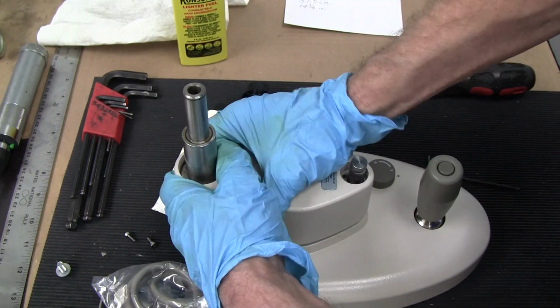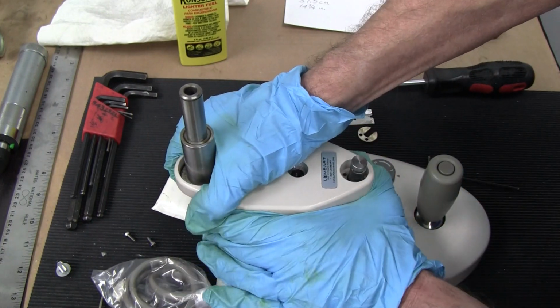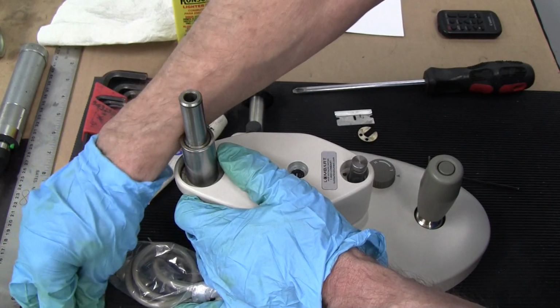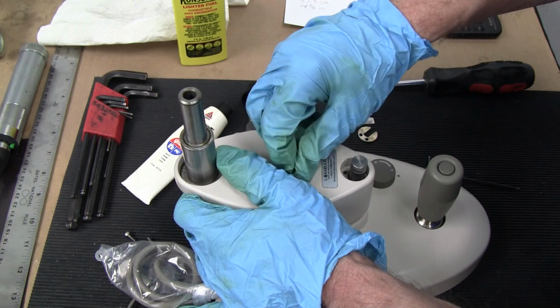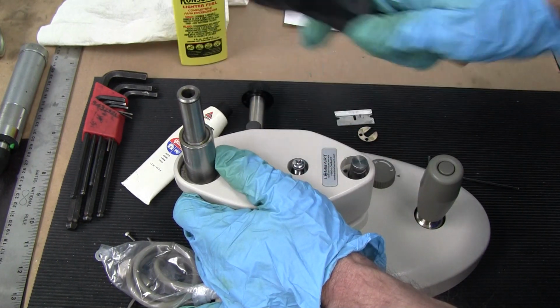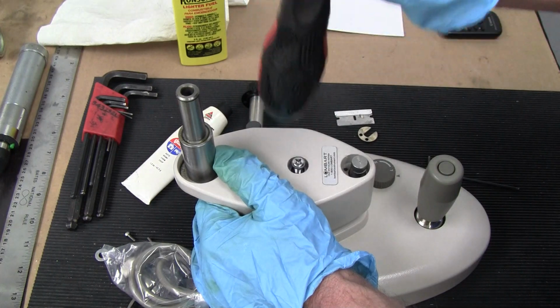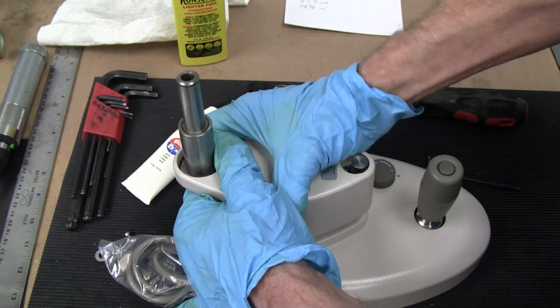Pull that out. Now it's going to come up because we have released the bearing assembly underneath, so it's going to come on up. Now you might want to make sure if this is coming up, you might want to put your screw back in and tap it while you're coming up, because you don't want that bearing assembly to come out. It shouldn't, but if you just wanted to make sure, go ahead and knock it down so that it will fall and release.